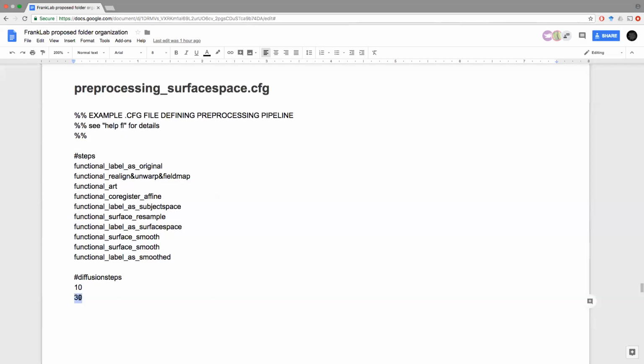Just a related follow-up question. I thought when we discussed before in some lab meeting about the level of smoothing to use, it was recommended to use minimally smooth, at least in the context of my data. I'm just not completely clear as to why we would use one versus the other. Sorry, I didn't fully understand. Could you repeat the question? So previously, when we were looking at the S-rate data, in some lab meeting I had presented some data, and I think it was Frank who recommended using minimally smooth data, not the maximal smoothness. So I'm just trying to understand why.